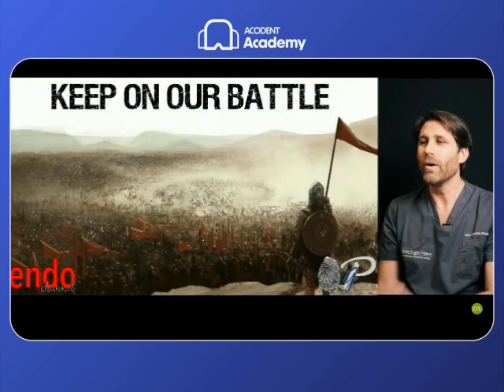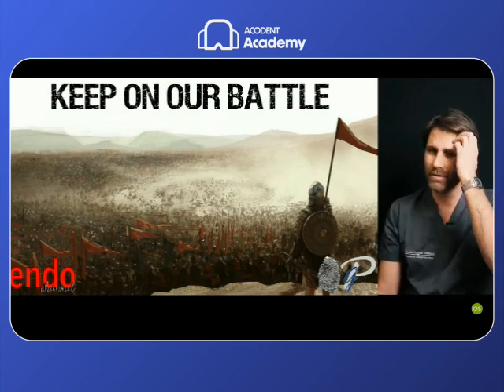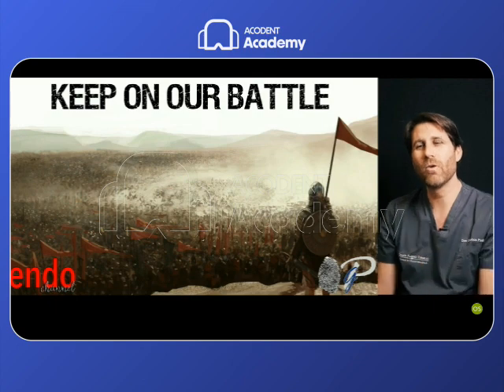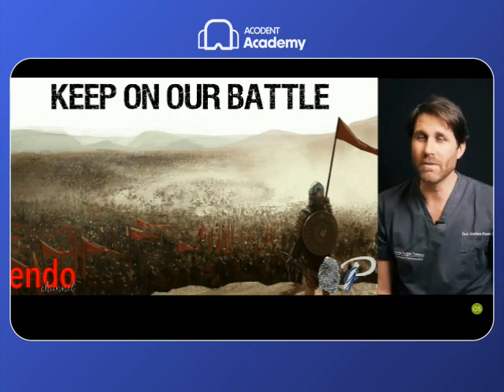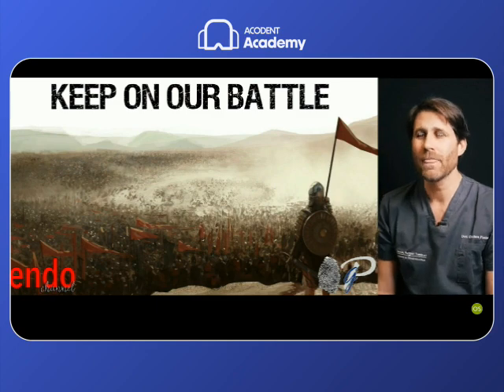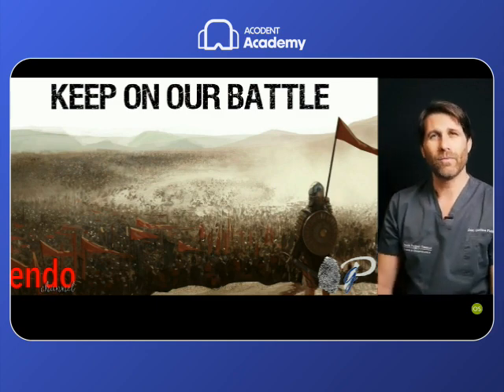So we can do it. I do it especially on retreatments, not in primary treatments. On retreatments, we have to open something in which we need more power. In a primary treatment, there is no reaction from a previous treatment. So it's probably something that is given by a trajectory. So in retreatments, I use more the M-Wire instrument.